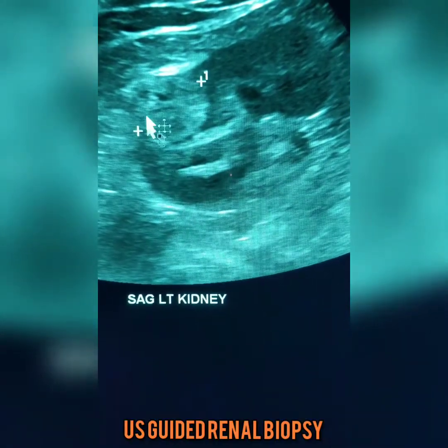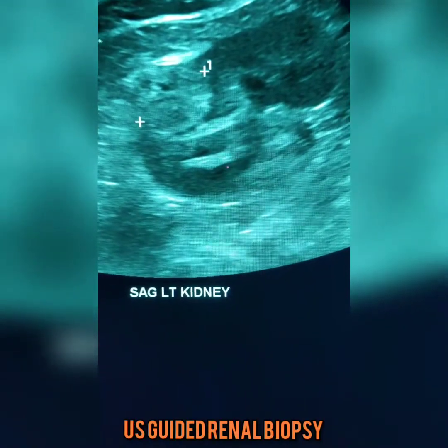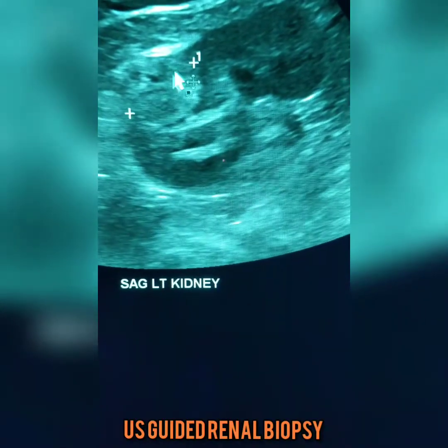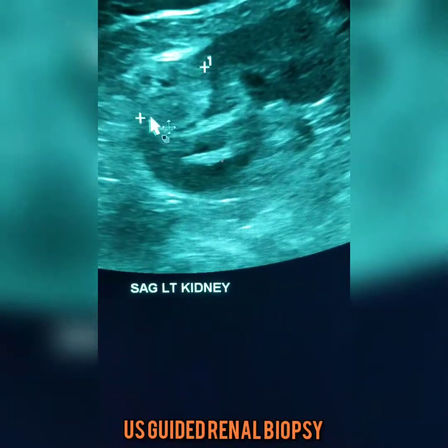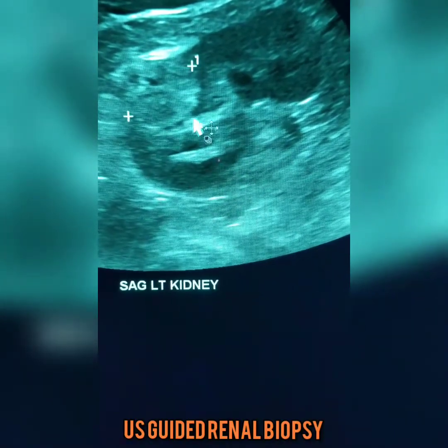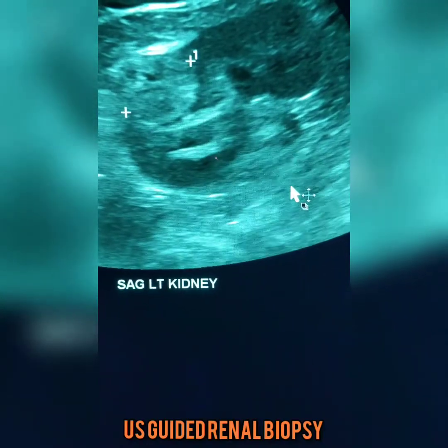So basically this is the kidney on ultrasound — the dark part is the normal renal tissue. The patient's head is up in this direction, feet down, and skin is up here. It's sort of kidney bean shaped — kidney beans look like a kidney, not the other way around. Here is the mass: it's this brighter grey area we're measuring here, and it's about 3cm wide. That was found on ultrasound, so then we went and did a CT.